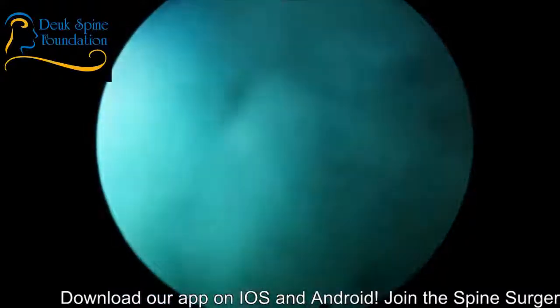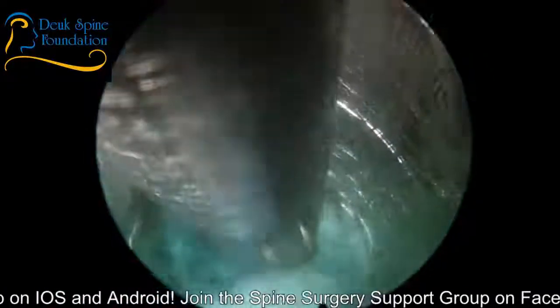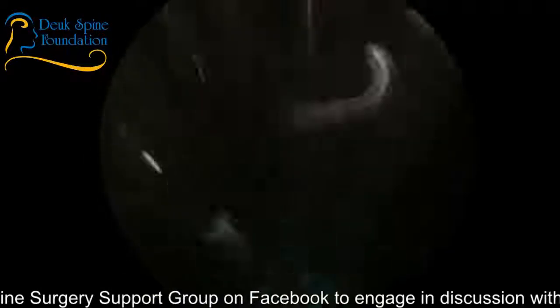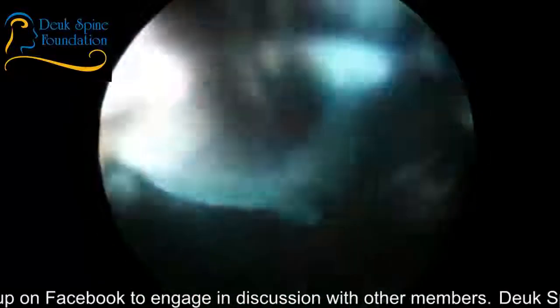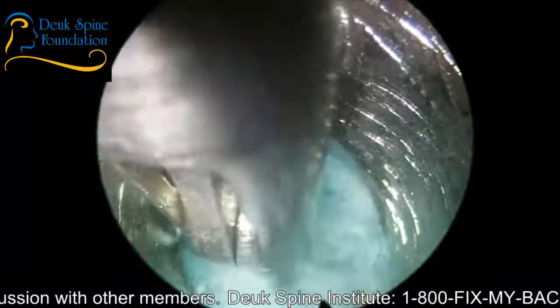I have a question. Yes. One of the viewers says, when Dr. Deuk injected the dyed L5-S1, he said it went right in. Does that indicate that the disc at this level did not contain the dye and has substantial fissures? Yes, it indicated there were huge fissures and that the dye just leaked out, basically. So it did still contain some of it, but a lot of it just leaked out through the tears, the fissures. And I didn't get to really pressurize the disc at all to elicit a painful response because everything just leaked out.